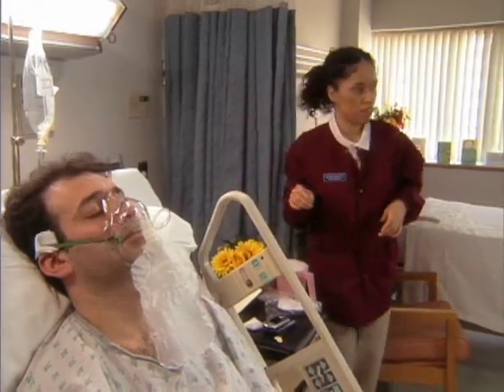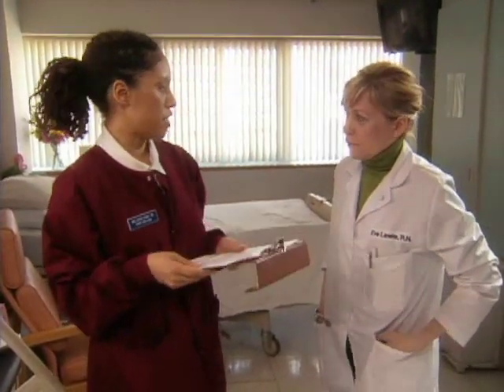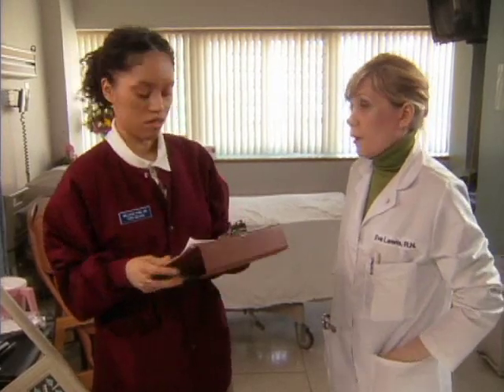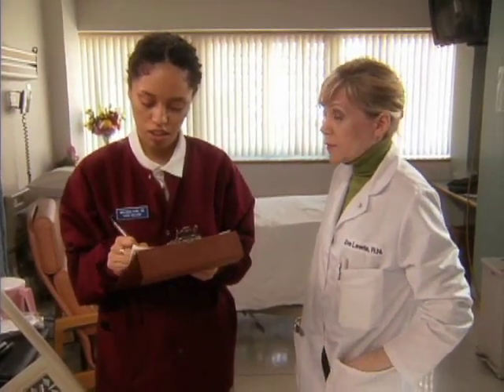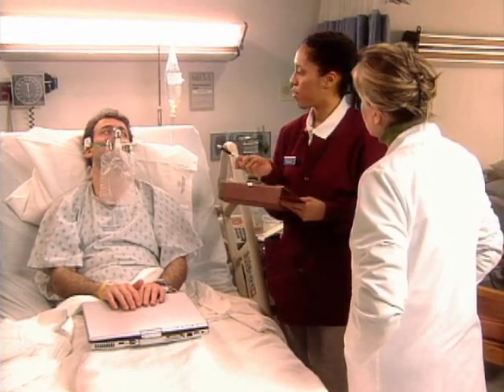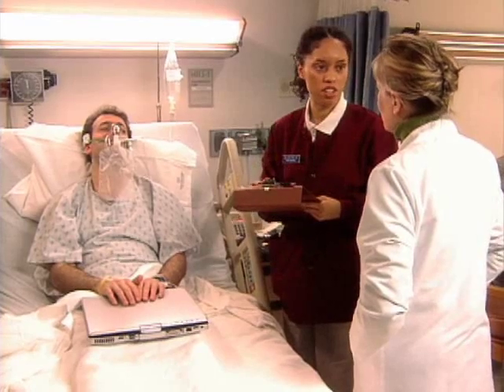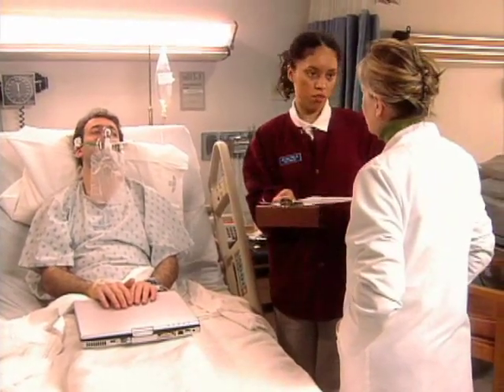Okay, everything looks great. So, right, I'll document, including my assessment, the type of mask used, liters per minute flow, and the patient's reaction to the procedure. Great. Now, skin integrity can be compromised due to moisture and pressure under the mask. So regular assessment of the area under the mask is an important part of care. Right, so I'll remove the face mask and dry the skin every 2 to 3 hours and check for any skin irritation. Good. And powder should never be used around the mask. Got it. Won't touch the powder.